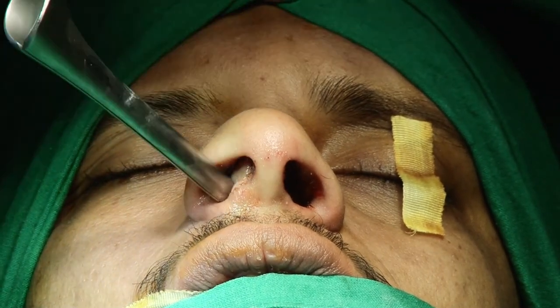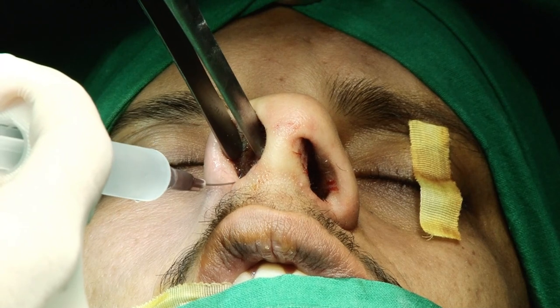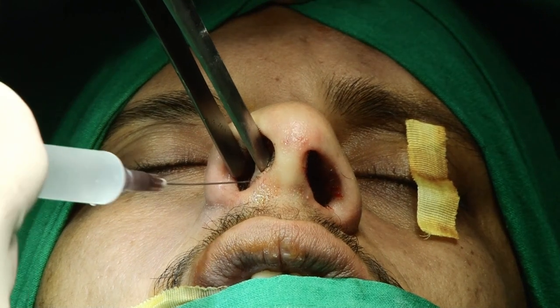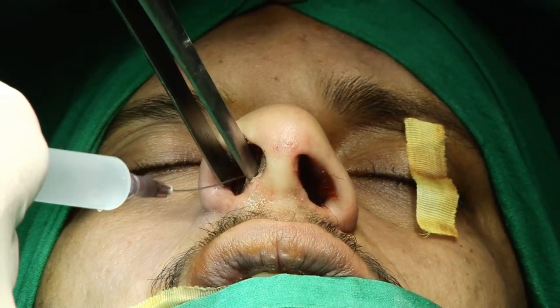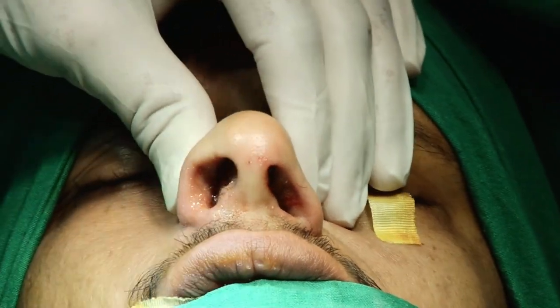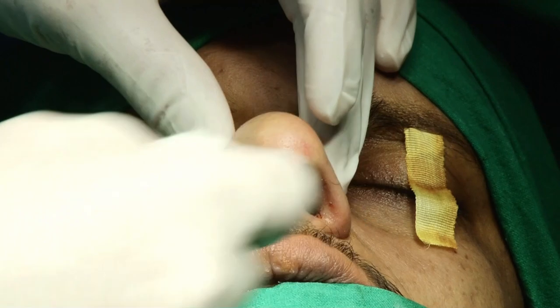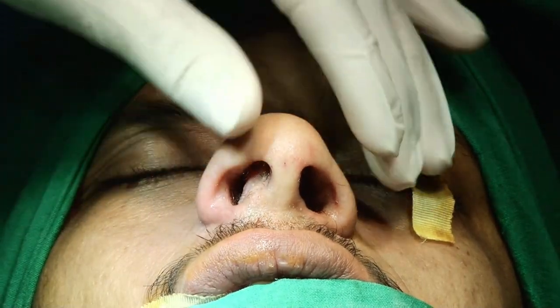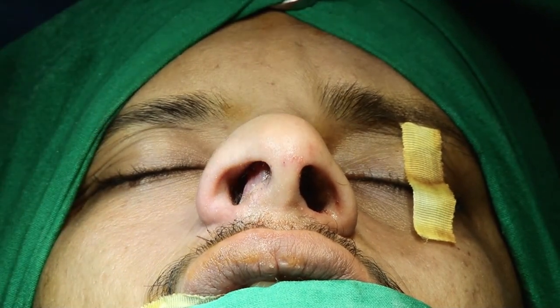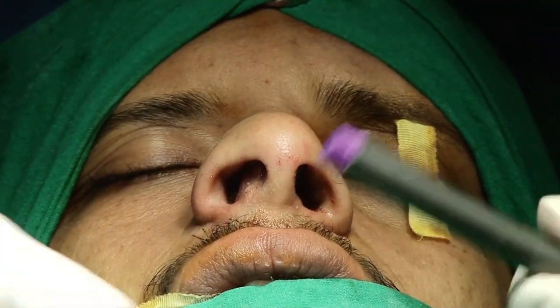What is regarding the CT scan? Basically I usually don't need a CT scan, but sometimes if a patient has a mediclaim, or if I suspect sinusitis also, then you go for a CT scan. Yes, this patient has a CT scan because of some nasal discharge also, just to rule out any sinonasal polyposis. The septum is twisted and the right side internal nasal wall is compromised, but the sinus is clear. So this is the first step.